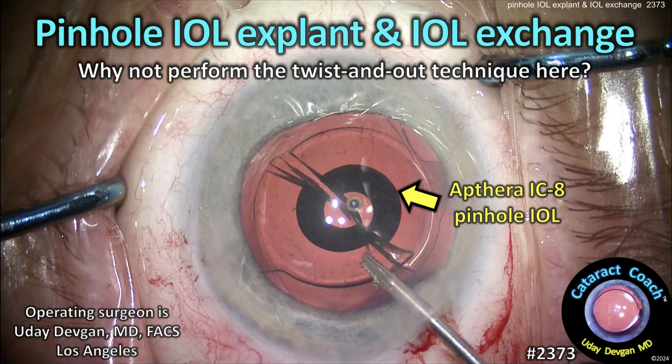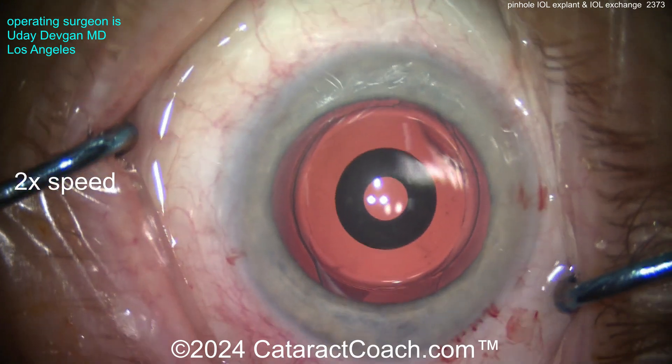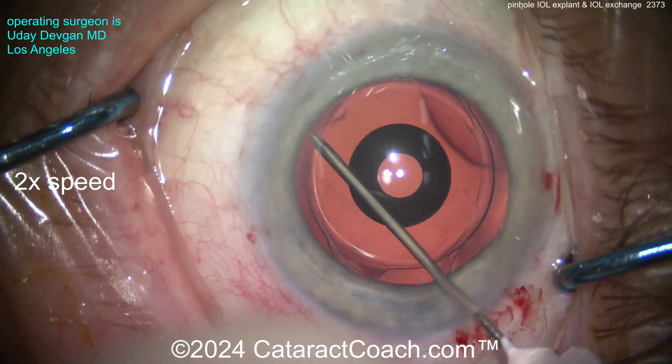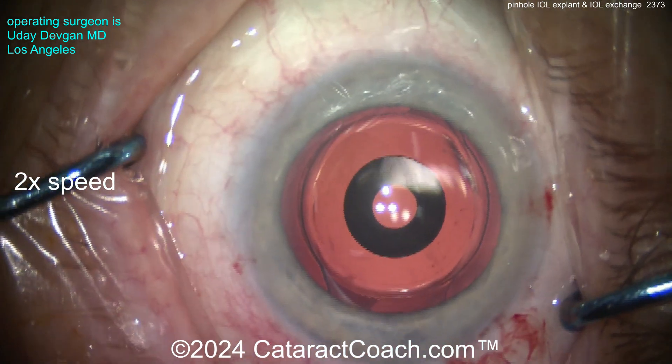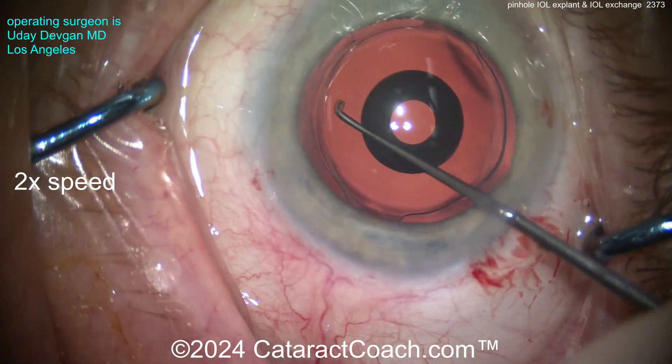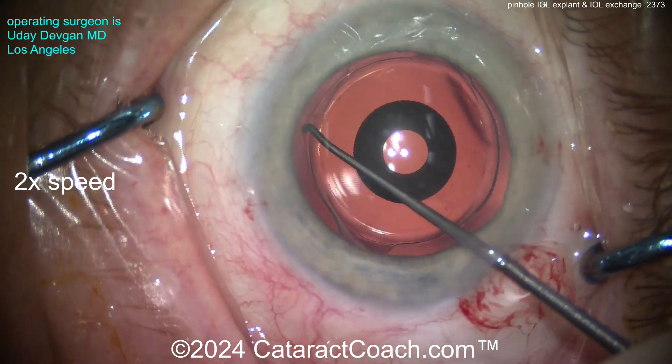From cataractcoach.com — pinhole IOL explant and IOL exchange. Why not perform the twist-and-out technique here? This is a patient who received the Apthera IC8 pinhole lens; the central zone is about 1.36 millimeters. The patient has had this lens in for a few months and just cannot tolerate it — more on that later.